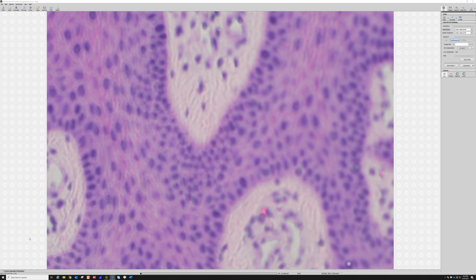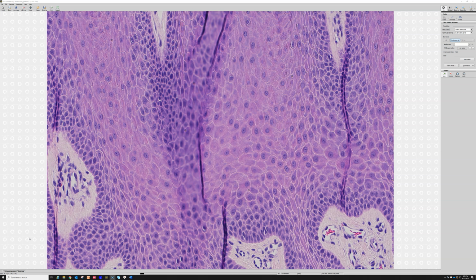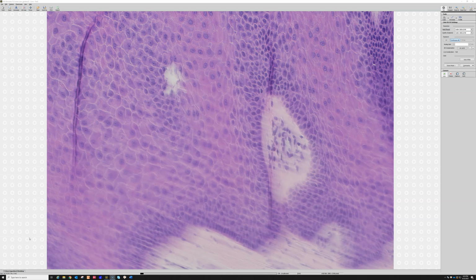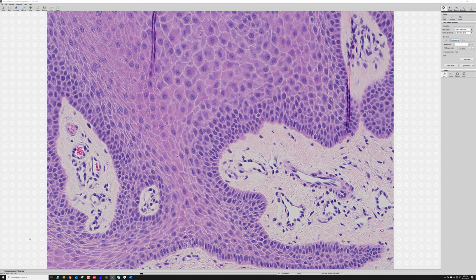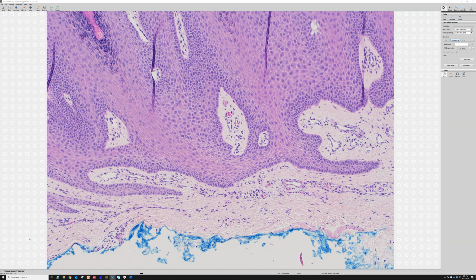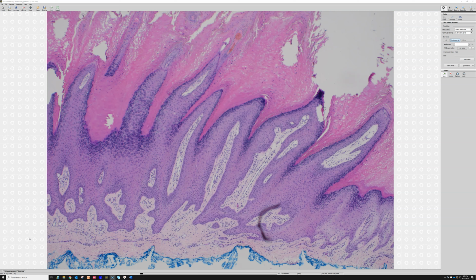All right, so look, the reason you can see there's a little bit of edema, a little bit of spongiosis. That is edema fluid that's seeped up from the dermis into the epidermis and is kind of stretching apart the keratinocytes there. So warts, just like other skin, can get inflamed. They can get spongiosis. Sometimes the body makes lymphocytes come and attack the wart, and they can get lichenoid change and dying keratinocytes. We don't have that here. But you can have all variation of inflammatory changes in a verruca, okay?